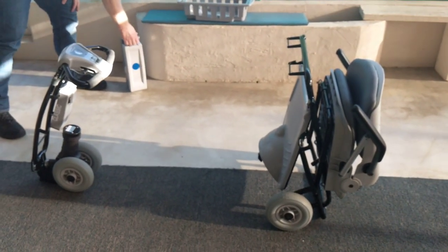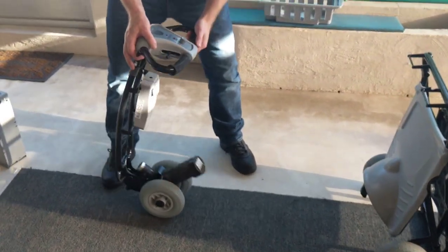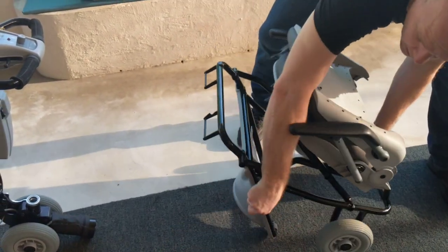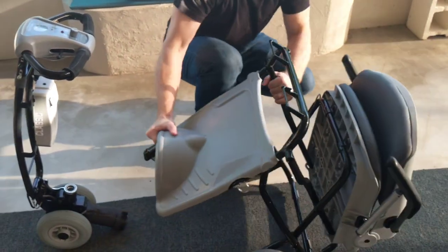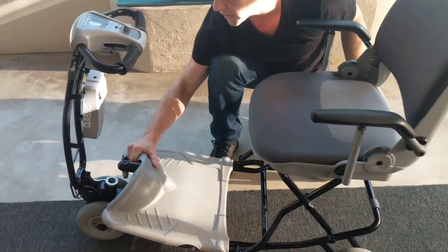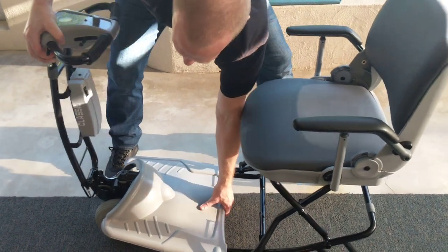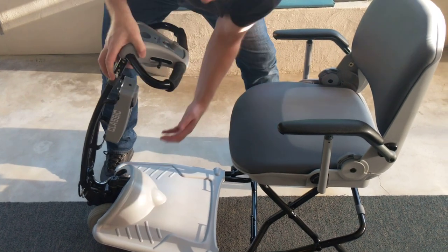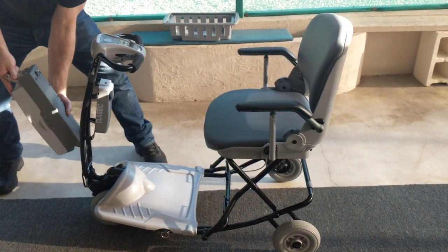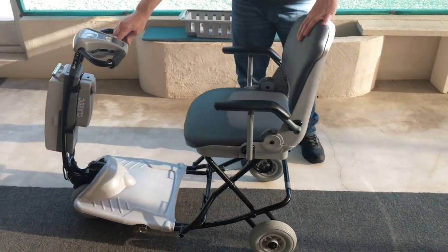To put the scooter back together — we unfold, we unlatch, we disengage and unfold. Once the seat is in the desired position, lock it into place. Disengage on the steering column, drop that part directly down, engage the steering column, and it is locked. Put the steering column back, put the battery in, turn the key, and your Lexus Light is ready to roll.